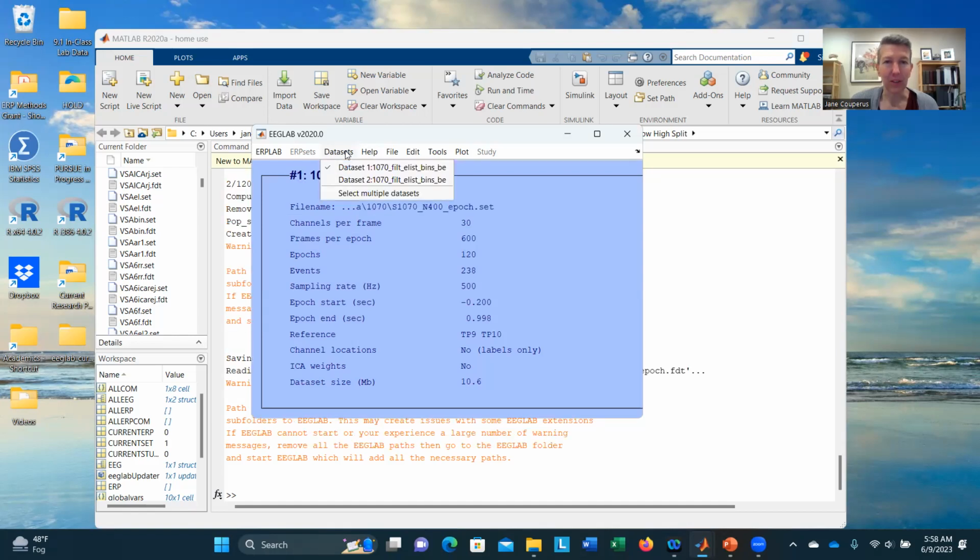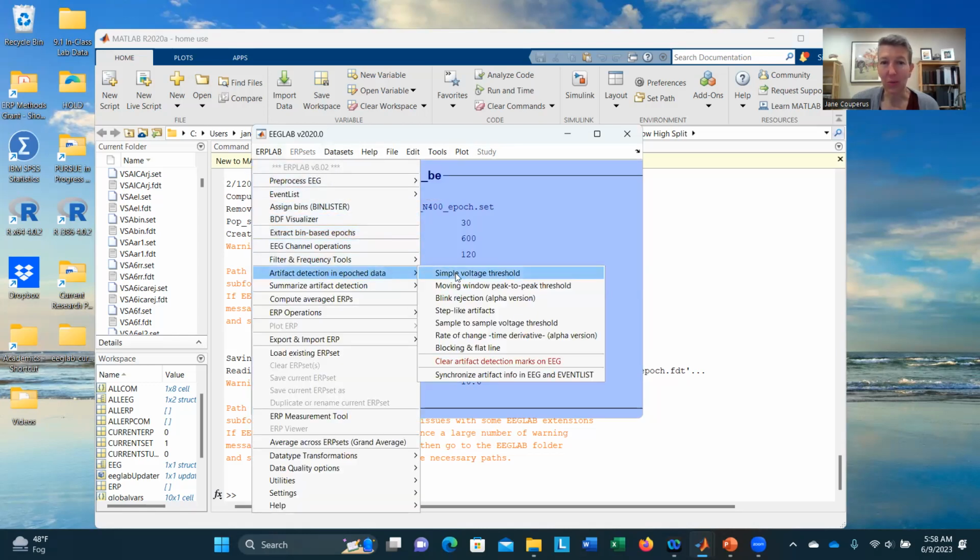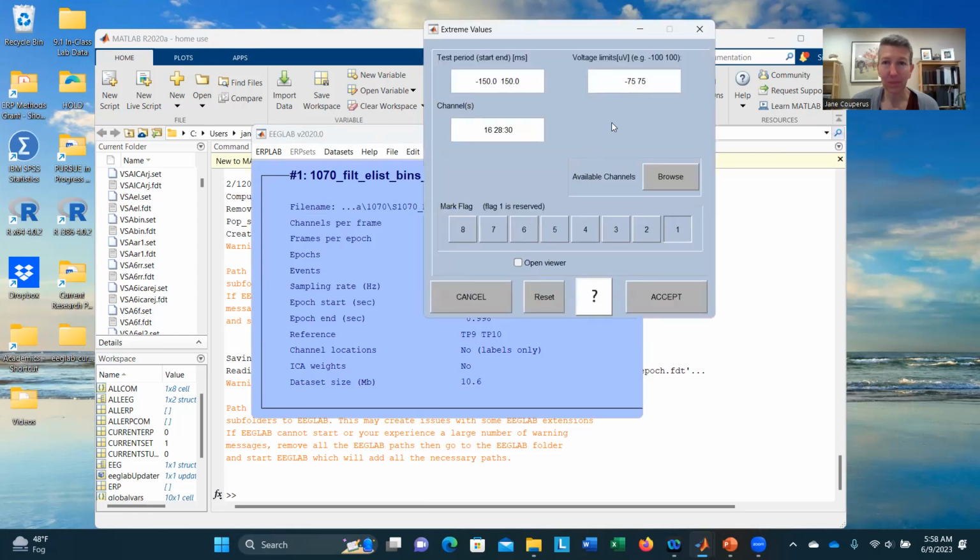And so it's still there. It doesn't have that AR1 on there, but that's just something it has in the system. So if I can look back. So we're now back on our initial data set that has not been artifact rejected. We're going to do it again. This time, we're going to use a simple voltage threshold.